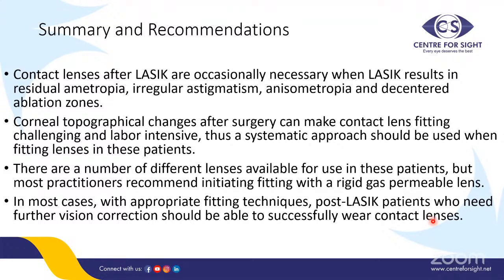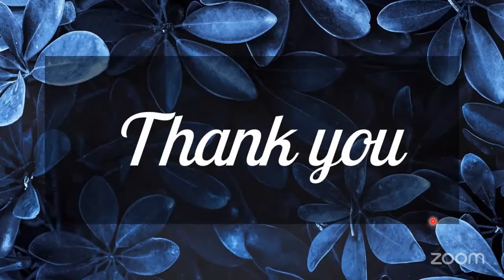There are also a number of different lenses available, so all the options should be given to the patient. And also, with appropriate fitting techniques, post LASIK patients who need further vision correction should be able to successfully wear contact lenses. Thank you.